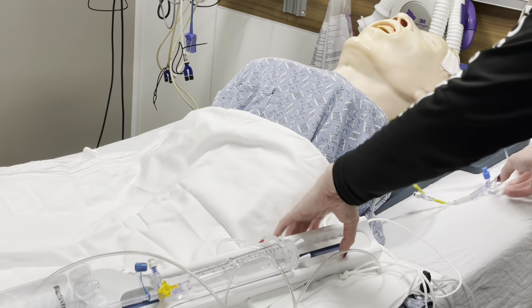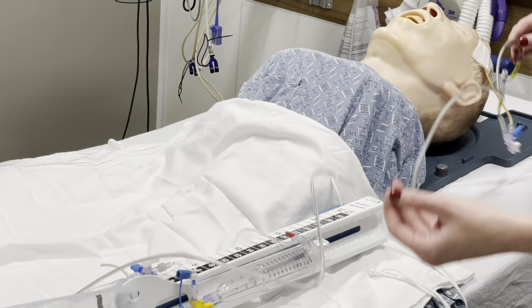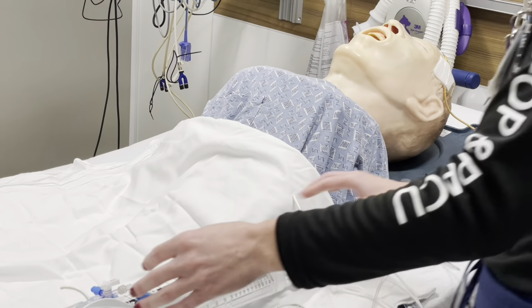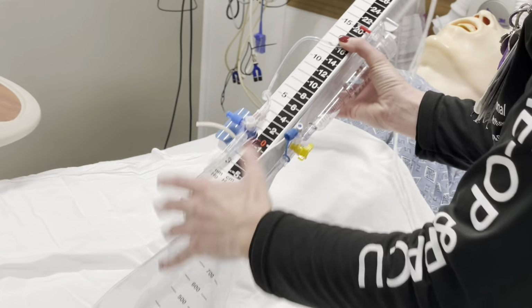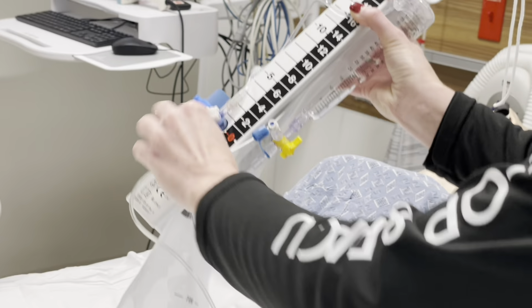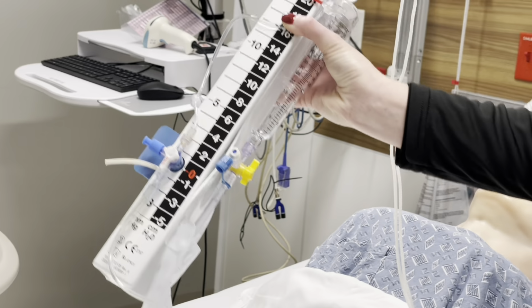Okay. We're going to trace it all the way down, making sure that we don't have anything sitting on top of it. You don't want this drain being pulled out. And then you're going to go off to the patient this way as well. So off to the patient is going to be downward. You follow the tube all the way down.